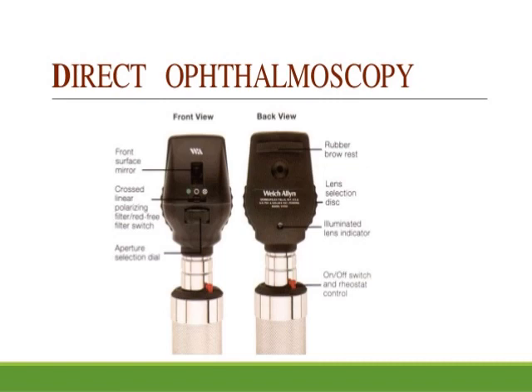It is usually performed routinely before the direct ophthalmoscopy as it gives a lot of useful information, and it can be performed with the help of a self-illuminated ophthalmoscope, which can be seen here, or it can also be done with the help of a simple plain mirror with a hole at the center. For this, the light is thrown into the patient's eye, sitting in a semi-dark room, from a distance of about 20 to 25 centimeters, and the features of the red glow in the pupillary area are to be noted.